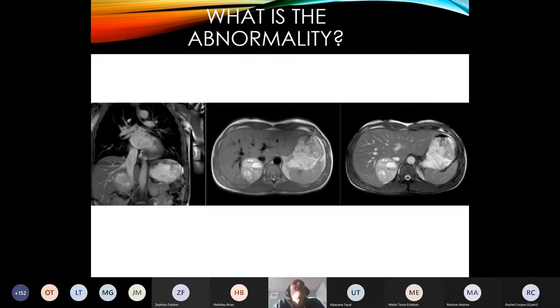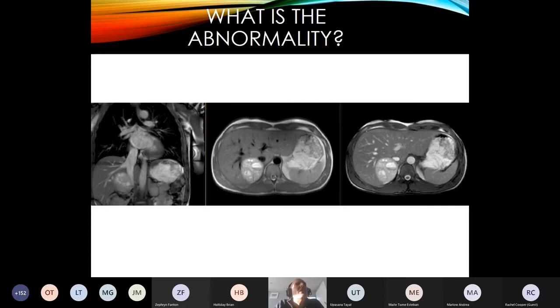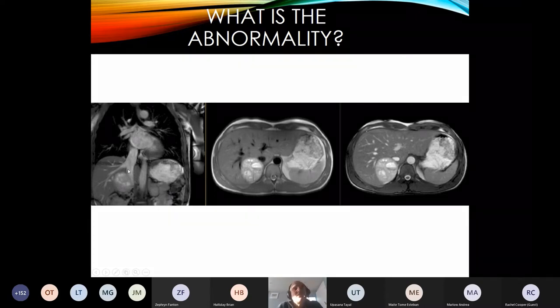For the more advanced members of the audience: this was a young man who presented with myocarditis, troponin rise and acute chest pain, and had myocarditis when we looked at his heart. But he had a very interesting cause — we actually wrote this case up. What you're seeing here is a funny-looking mass just under the liver, very easily confused with bowel. This is actually a phaeochromocytoma — an adrenaline-secreting tumour from the adrenal gland — and that was why he had myocarditis. So anatomical imaging in one or two percent of scans can be extremely helpful.